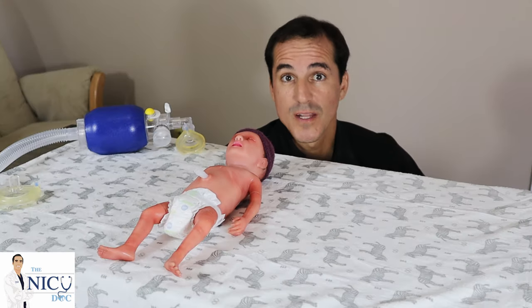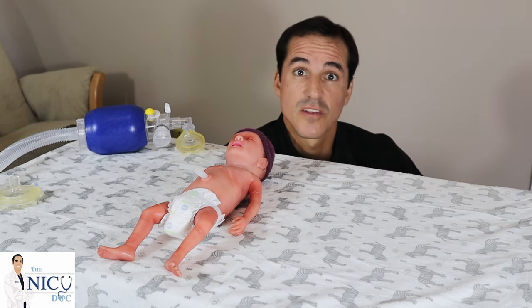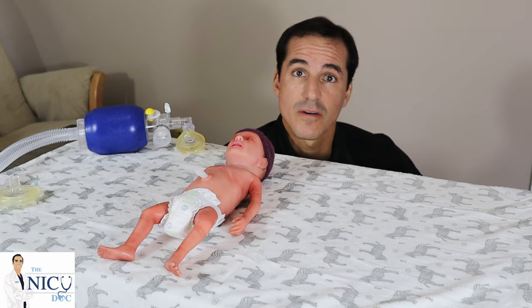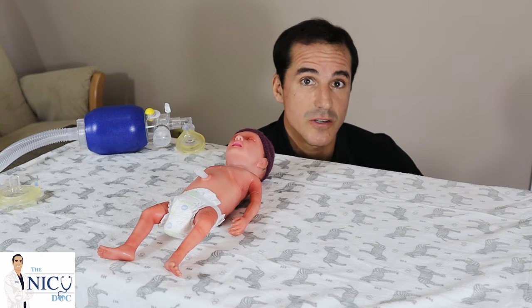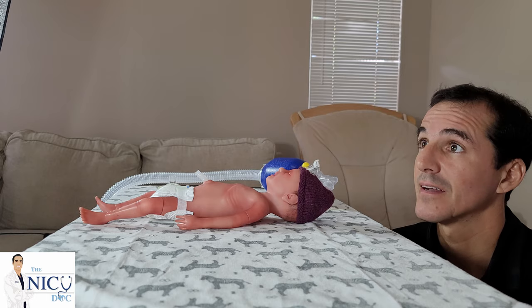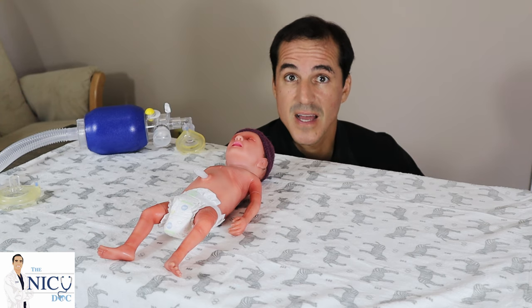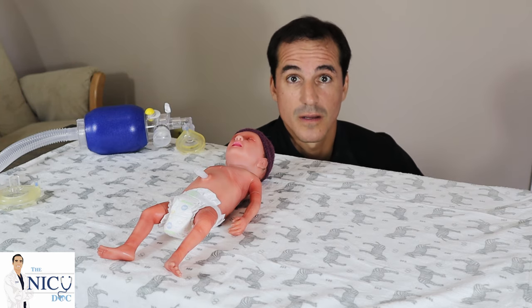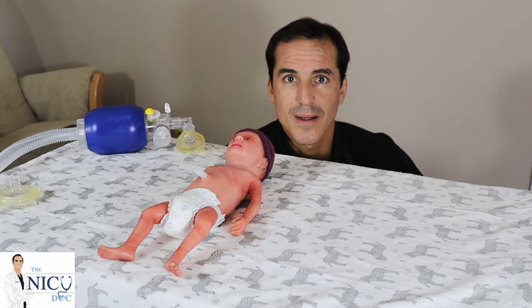It's really important to make sure you have a perfect tight seal around the baby. That does not mean it needs to be tight against the skin, but that you have very little air escaping so you're able to deliver as much pressure as possible straight into the lungs. For that, you choose the right size — preemie babies need the smaller preemie mask, older babies can have a larger mask. You want a tight seal from the nose to the chin.